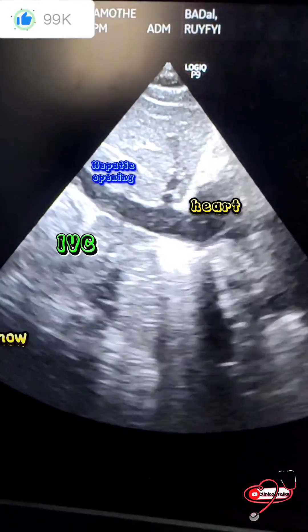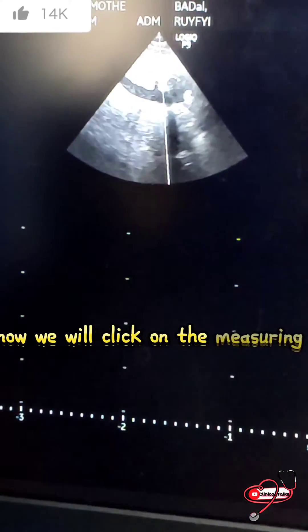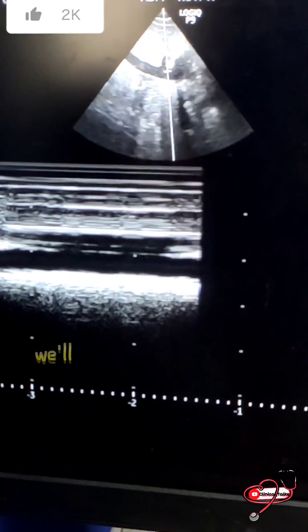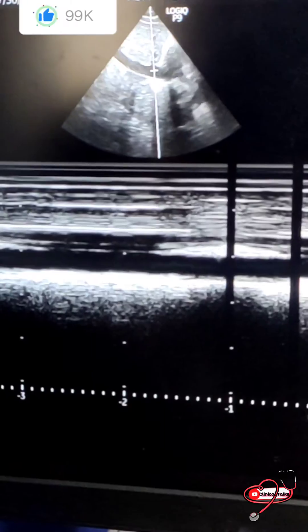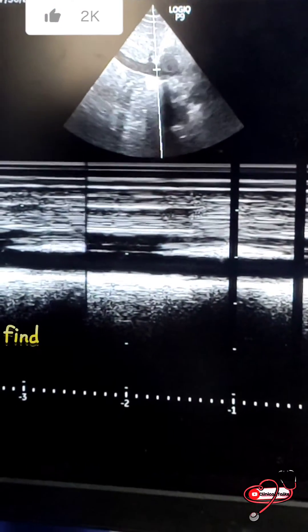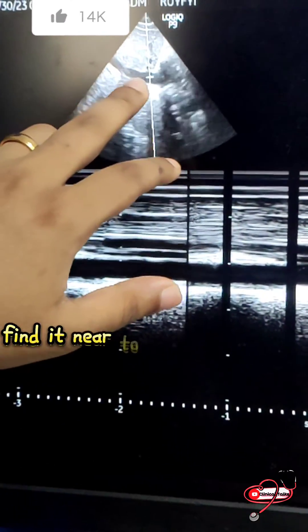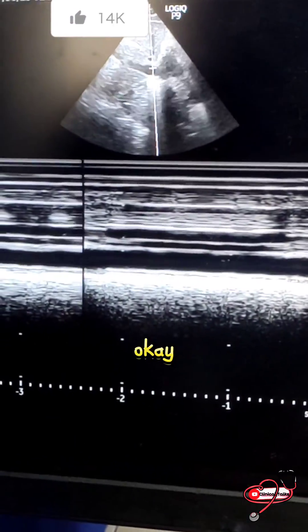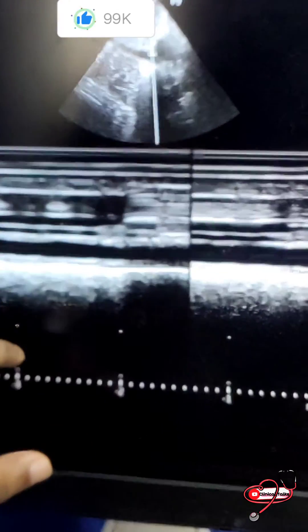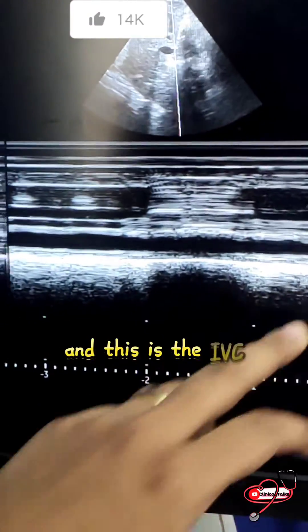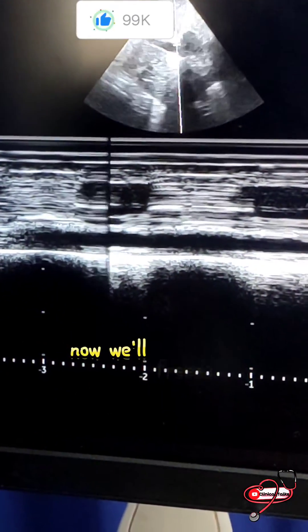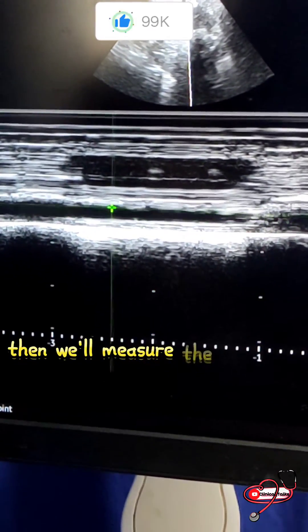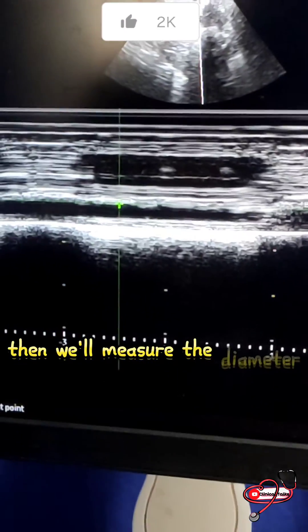Now we will click on the measuring mode M-Mode and keep the pointer near the hepatic vein opening. This is the IVC. Now we will freeze the image and measure the diameter.